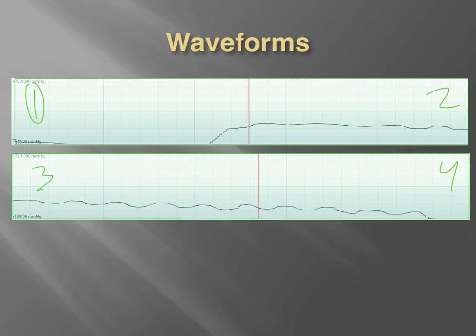What we have here is exhalation and compressions continuing during exhalation, causing what are essentially oscillations. Those of you that don't use a Rescue Pod, you'll see that.